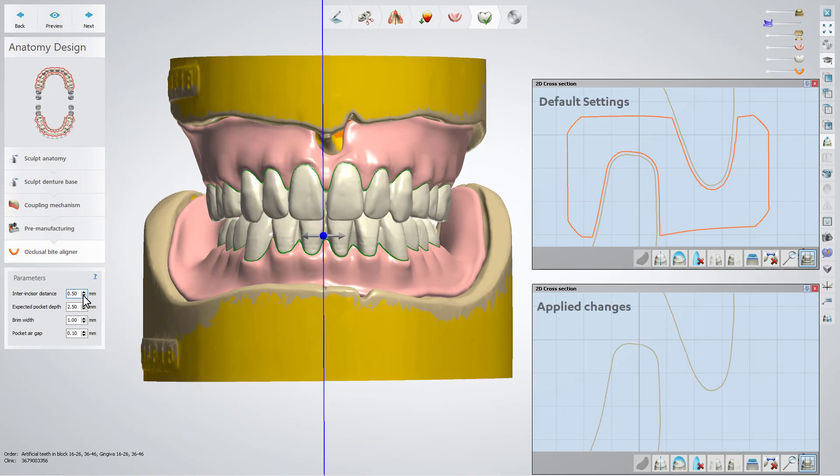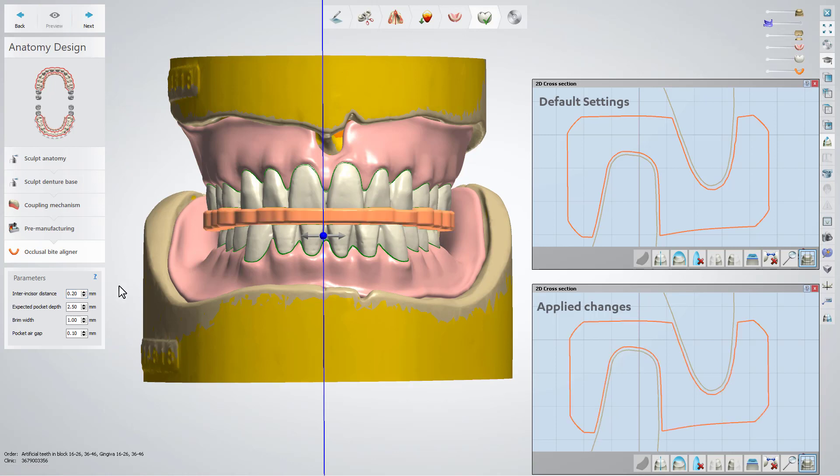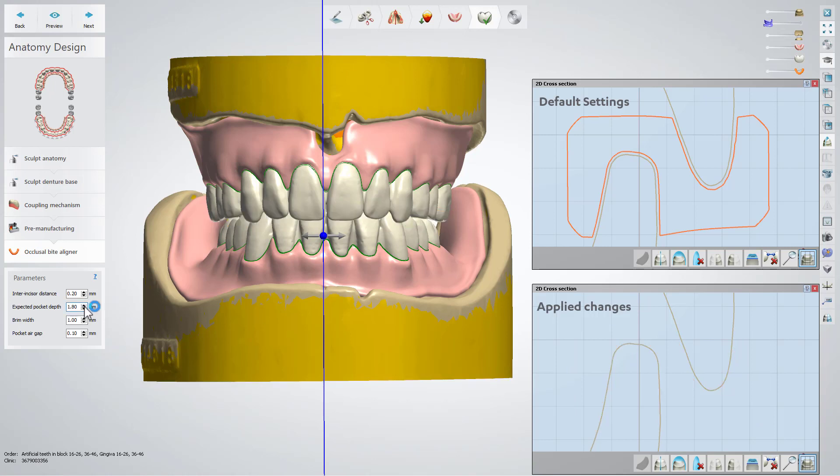You will have inter-incisor distance, which is the distance between the upper and lower incisors; expected pocket depth, which is the maximum pocket depth at the bite; brim width, the distance from the pocket to the edge of the occlusal biter liner; and pocket air gap, the gap between the pocket and the tooth.